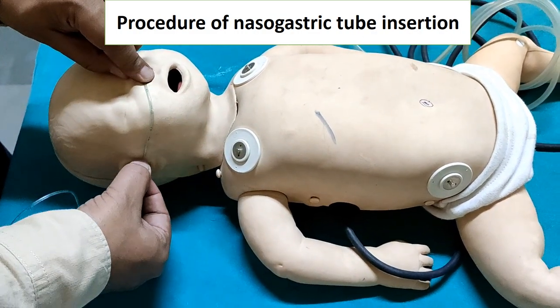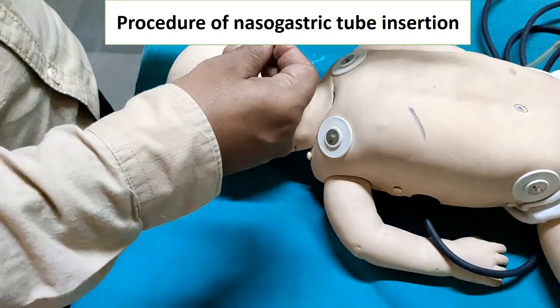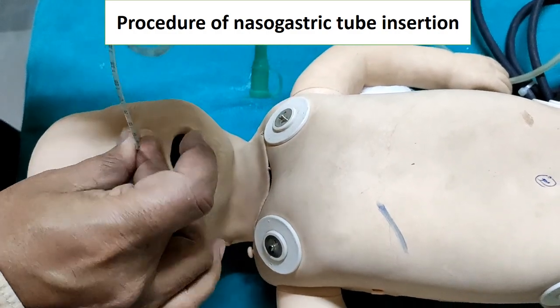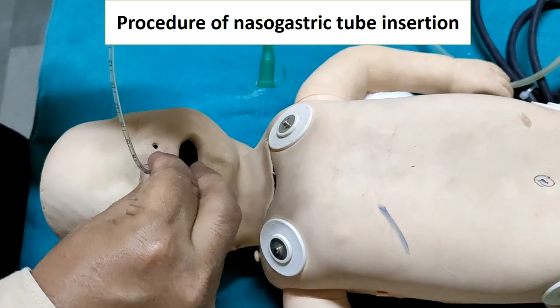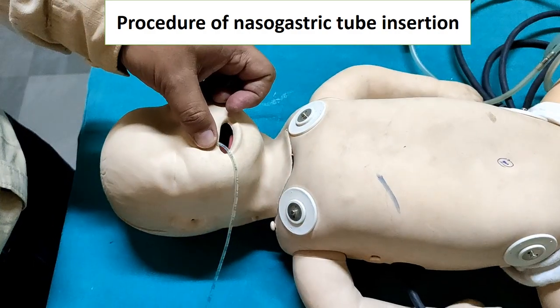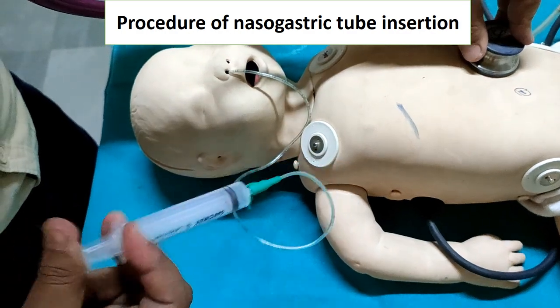For the procedure of nasogastric tube insertion, after measuring and marking the insertion length, hold the nasogastric tube between the thumb and index finger and insert through the nose — or through the oral cavity, which is called orogastric tube insertion. If the tube recoils into the mouth or the patient has a gag reflex, remove and try again. After inserting to the measured length, cross-check that it is properly placed in the stomach.